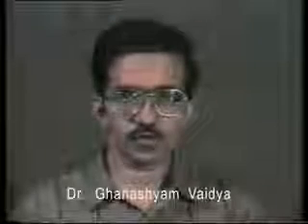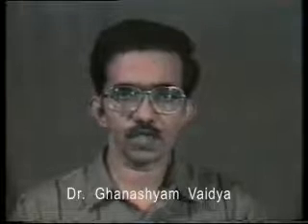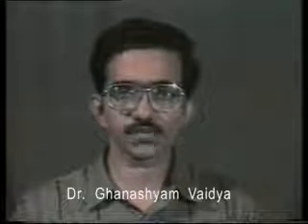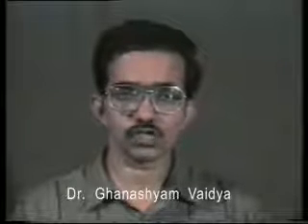Reading an electrocardiograph fascinates every medical student and practitioner. But what looks so simple and clear-cut in the books does not appear so when it comes to actual ECG reading in wards and clinics. This cassette aims to solve this problem by developing an eye to pinpoint the abnormalities and analyze them systematically.